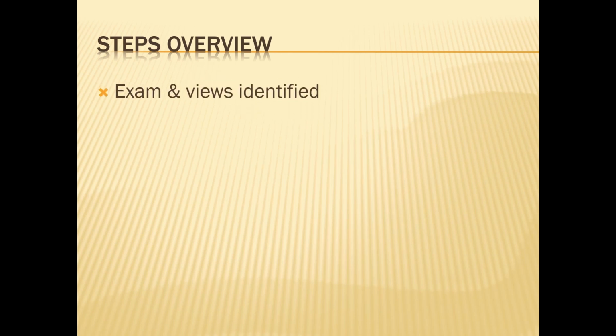If you are using a CR system, gather the imaging cassettes needed to complete the exam, one plate per view. If possible, this is a good time to mark the cassettes and associate them with the patient and view that the cassette will contain. For a DR system, now is the time to call up the patient's information screen and link the patient's information to the views of the exam. For both systems, it's important to identify each view in the exam to the view's metadata so that the view is properly processed by the computer.